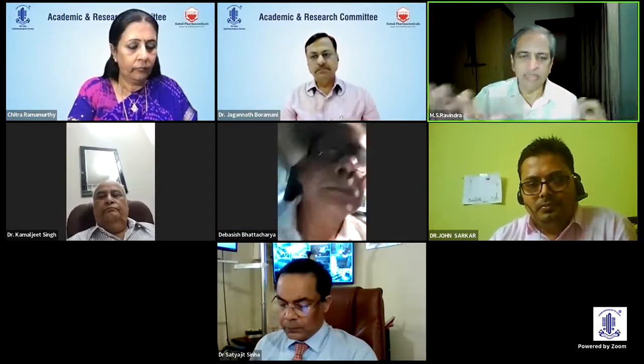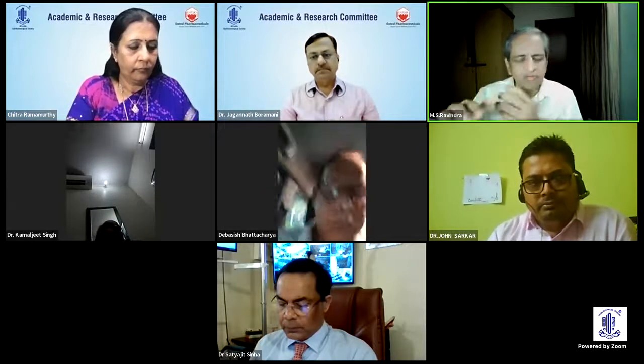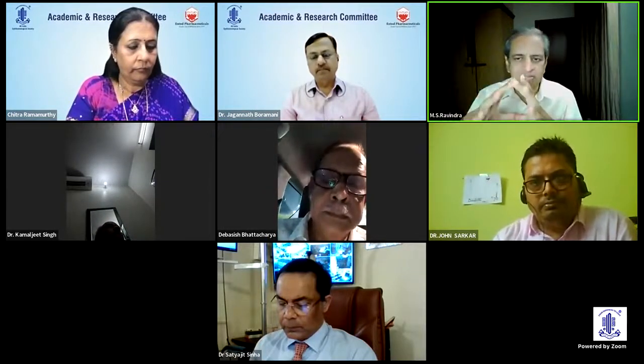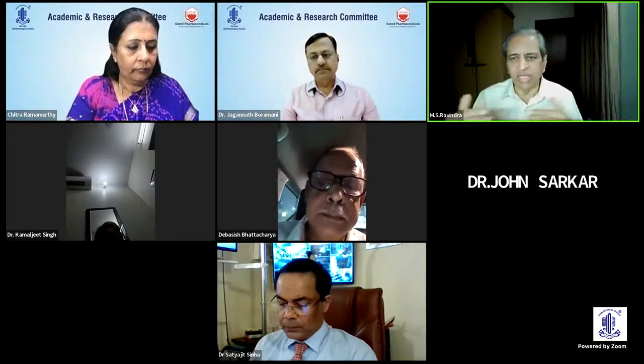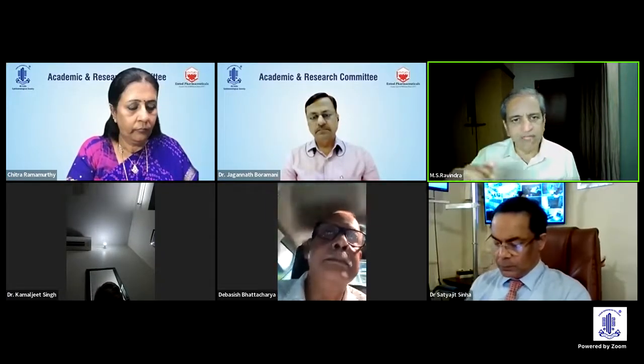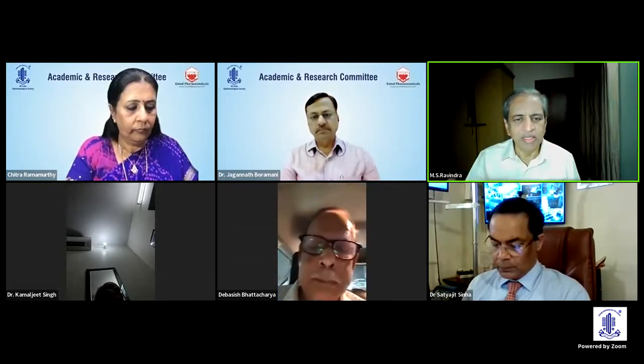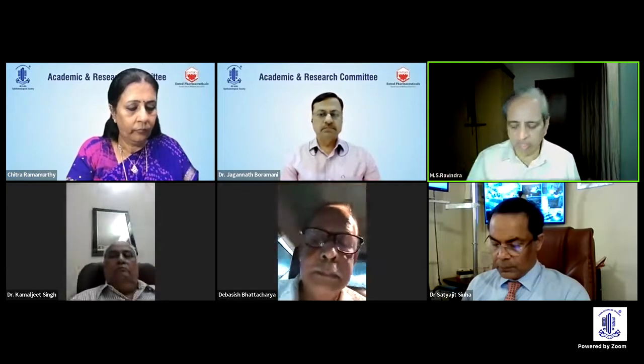Third is the crescent blade itself is too long. When you are going there, there's a lot of additional length which will hurt the lids, which keep touching the lids, and the patient will have sensations of the heel of the tunnel blade touching the lid, which can be avoided by selecting a tunnel dissector which is shorter in length.